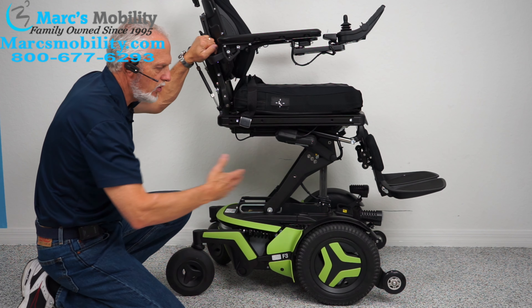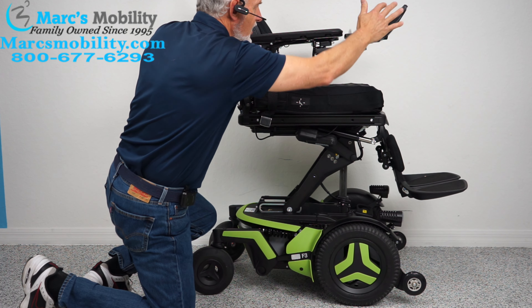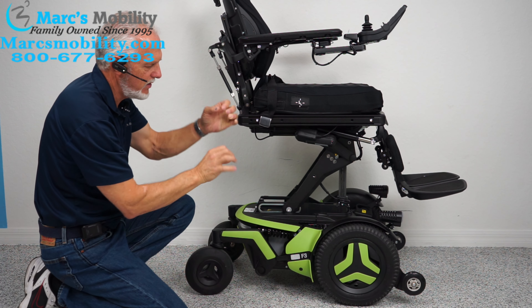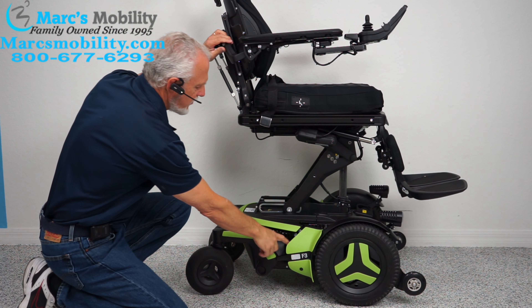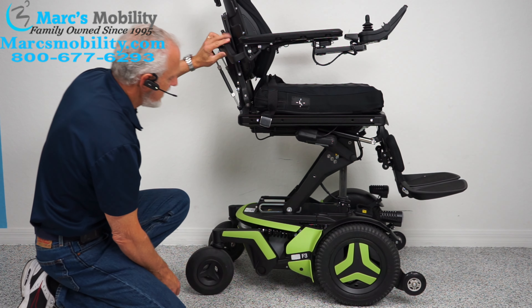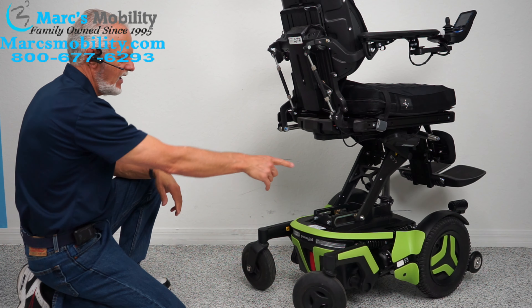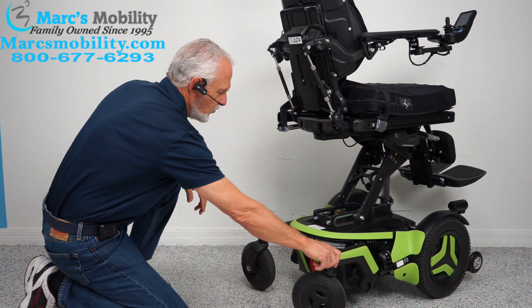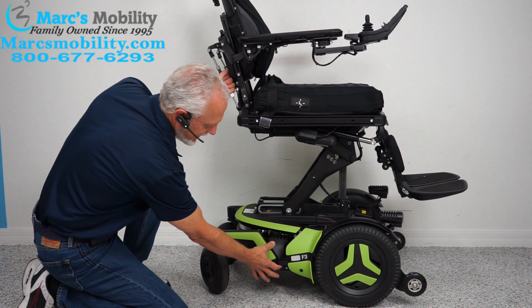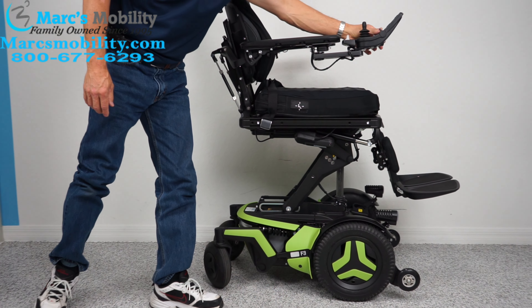If you ever had to roll it manually — if you can't use the joystick — you would turn the power off on your joystick. You want no resistance in the motor with the power off. Then take that lever here and push it down, which unlocks your wheel. You've got to do both motors, then you can wheel your chair around. When you're done, do not forget to put it back in gear and then turn your power back on.